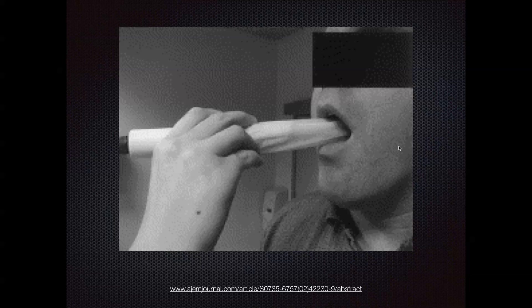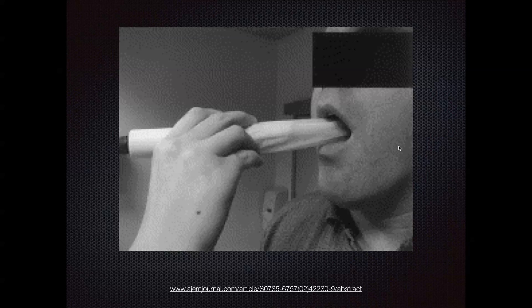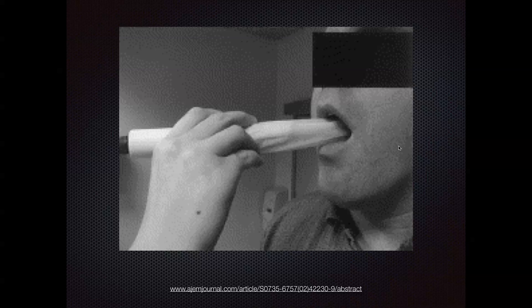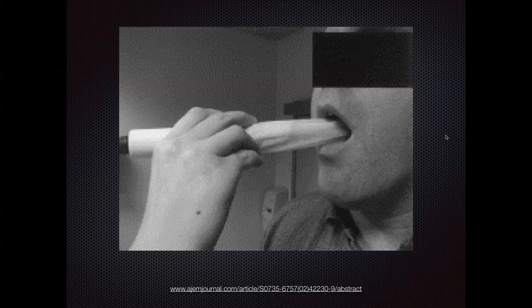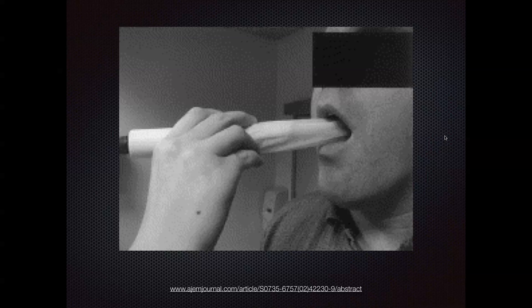To get a light in there and to stick a needle in there makes it very challenging. When this is done correctly, you've got the probe touching the exact spot where you want the needle to go, so actually seeing your needle fall in real time becomes a little bit of a challenge. Even when I've seen a very clear fluid collection, sometimes I still end up poking the patient three or four times trying to find the exact spot where I had my probe before.